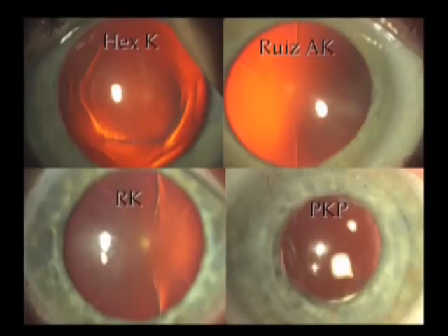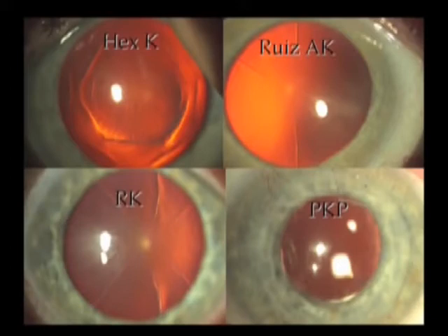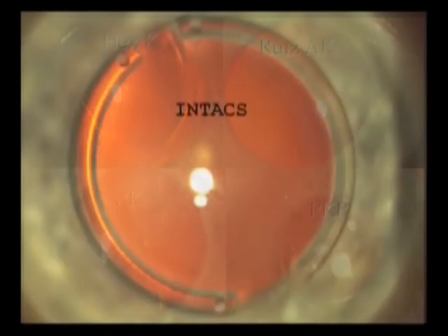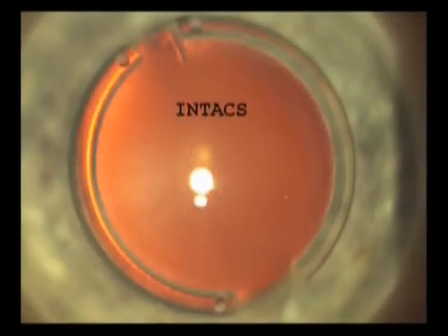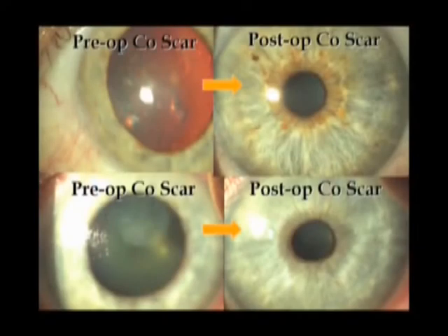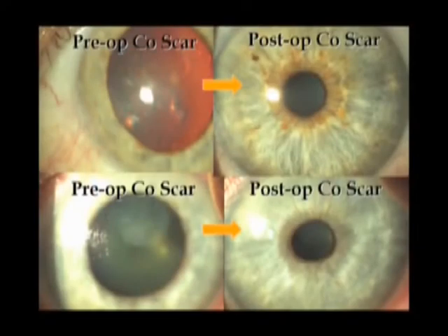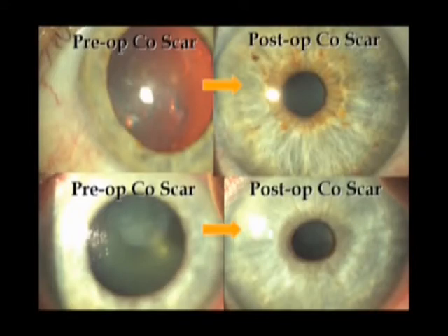In conditions of shape anomalies following previous refractive surgeries, laser ablation can be performed for excellent emetropic outcomes. Extreme shape anomalies like keratoconus can be stabilized using Intacs. Conditions of superficial scarring, as seen here, can be peeled right under the excimer laser with simultaneous refractive ablation for excellent visual and clinical outcomes.